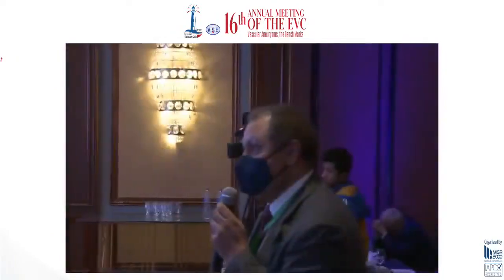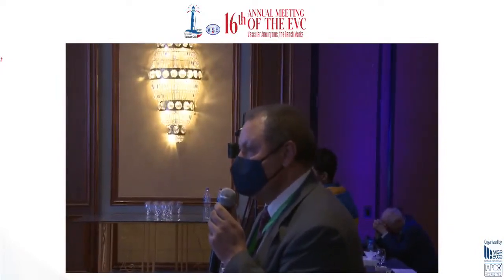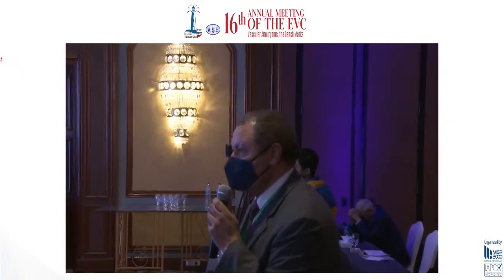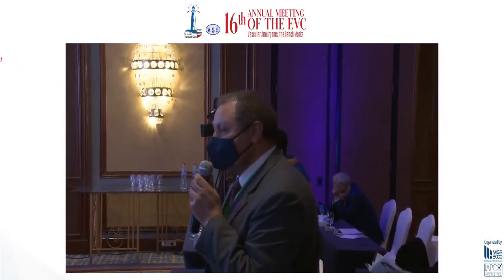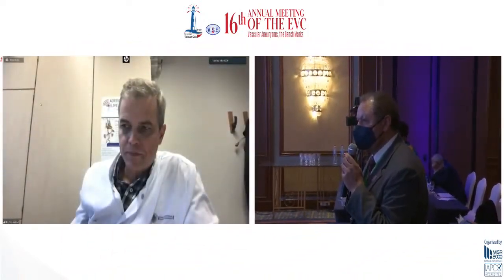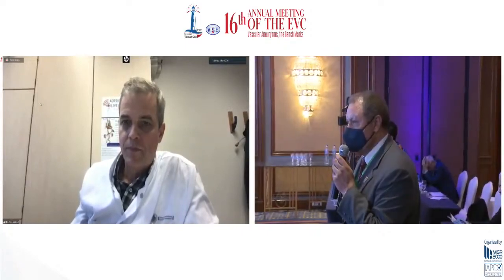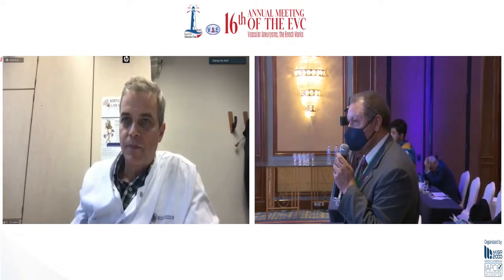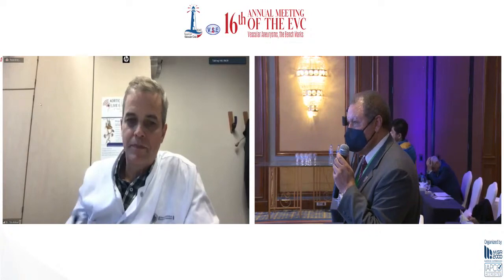Thank you very much for fascinating cases. I have a question regarding the first case in which you showed us the type 1A and B endoleaks which you managed by embolizing the intercostal arteries. And my question is, how safe is it to embolize many intercostal arteries without jeopardizing the spinal cord blood supply and to be afraid of having post-operative or post-procedural paraplegia?